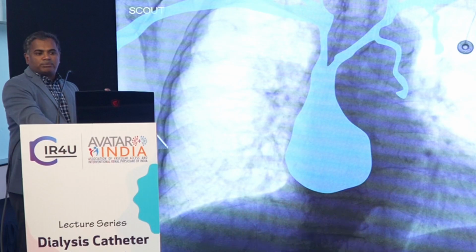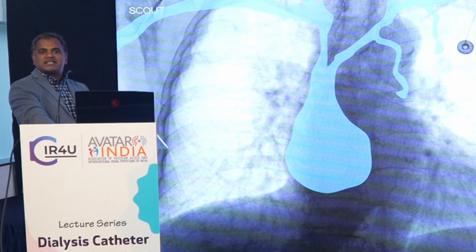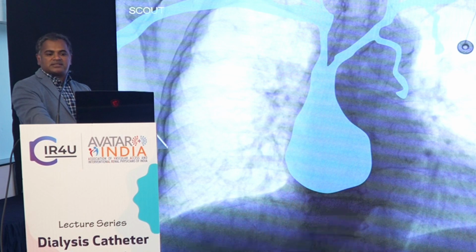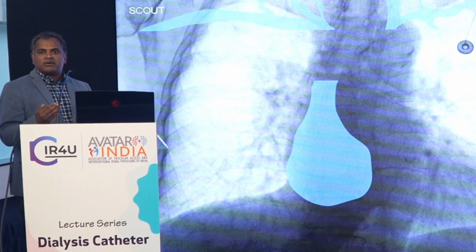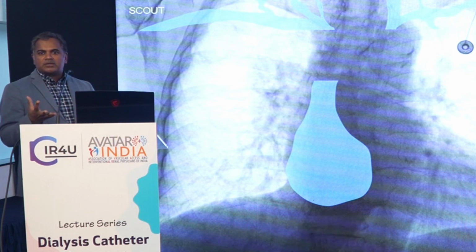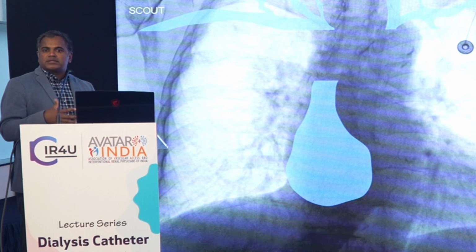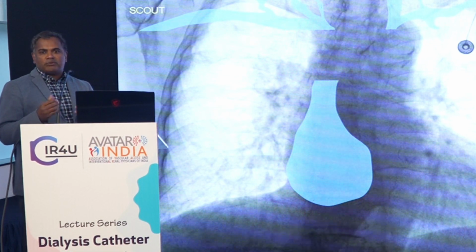So you should keep a close eye on this to see: is this acquired or is it something else? Sometimes you have occlusions. That means there's no connection from the outside vein to the central veins. This is commonly seen in SVC occlusions or brachiocephalic vein occlusions. So this is where central venous occlusion comes in. We can call this a disrupted venous anatomy.